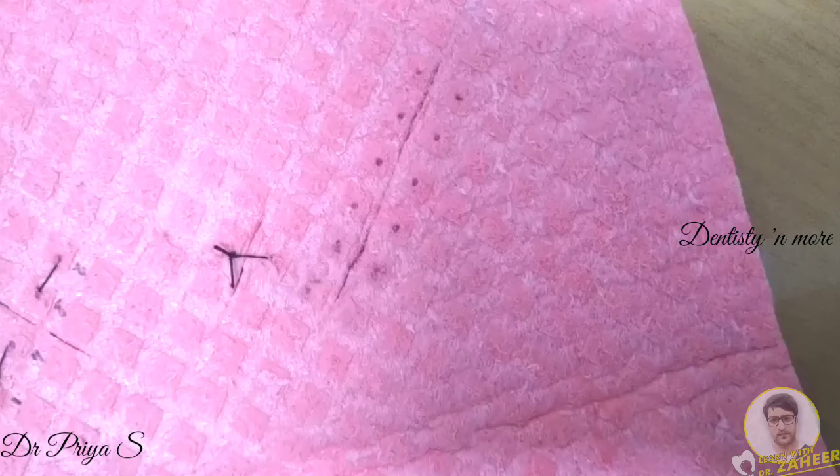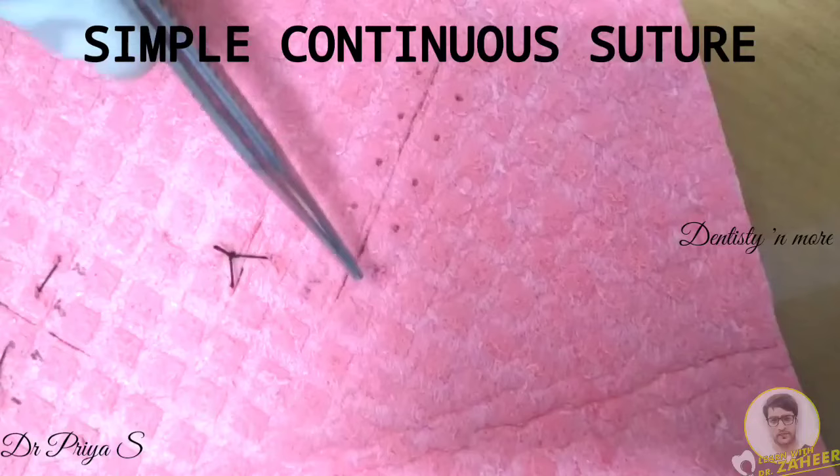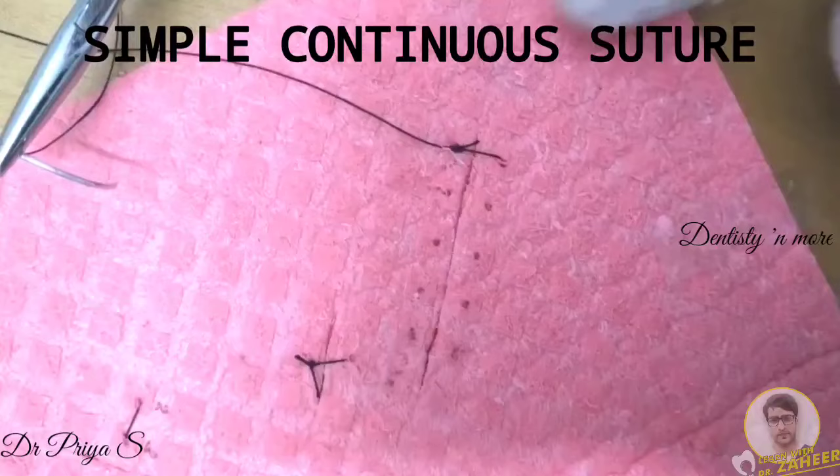Moving on to the next suturing technique: simple continuous suture. This provides a rapid, secure closure with an even distribution of tension along the length of the wound, which prevents excess tightening in any one area. It also provides better wound edge eversion and a watertight closure. The first step is to make a simple interrupted suture at one end of the incision line.